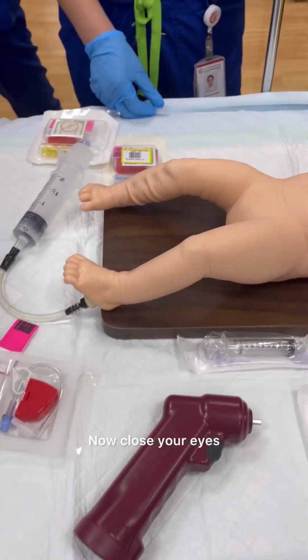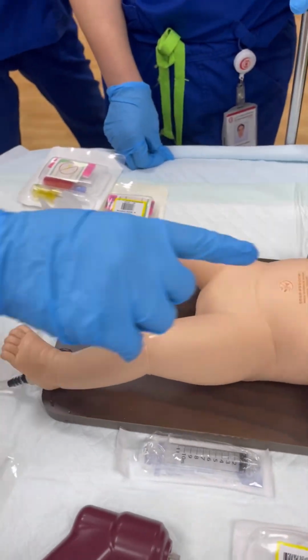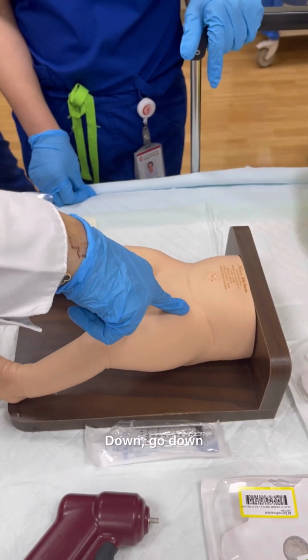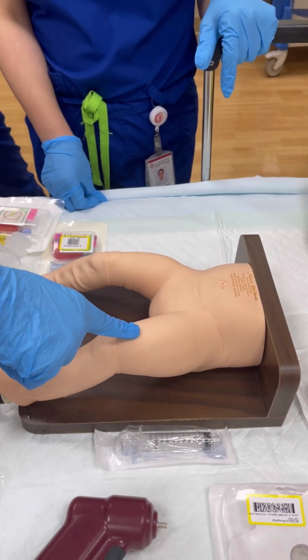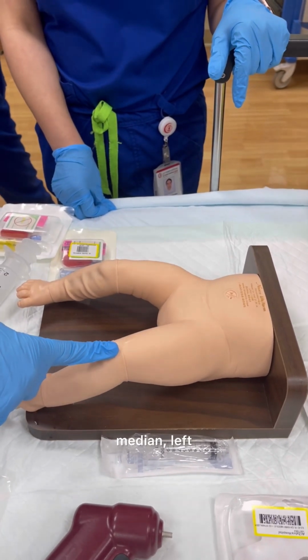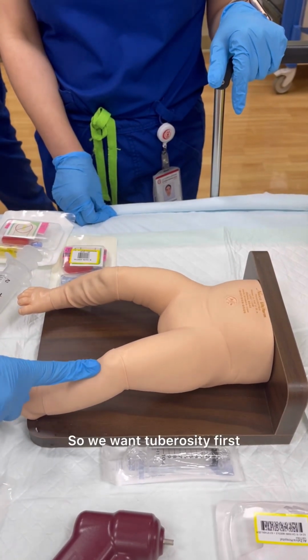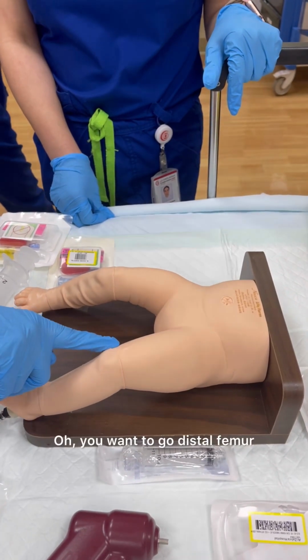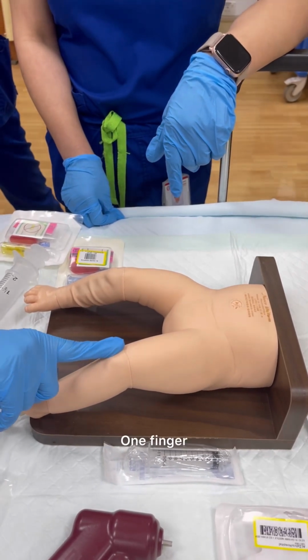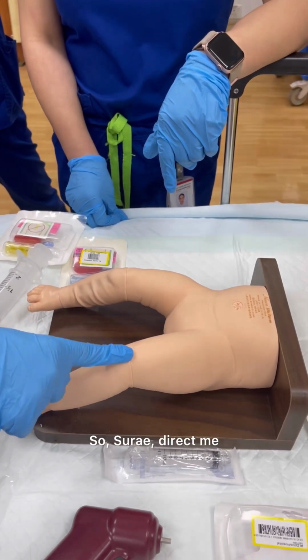Come here. Now I will close my eyes, and you direct me on where I could put the IO. I'm here at the proximal femur. Tell me where I will go. Go down, near the knee. Medial or left? Do I have to find something before I go left? Distal femur, fair, no problem. So we'll go left. One finger. Here. Good.